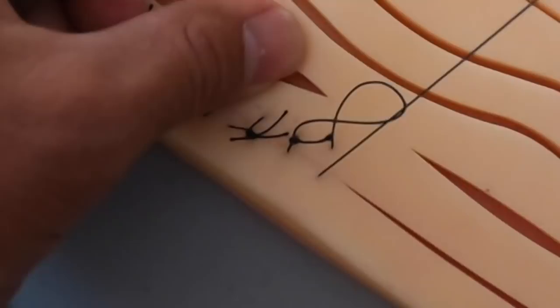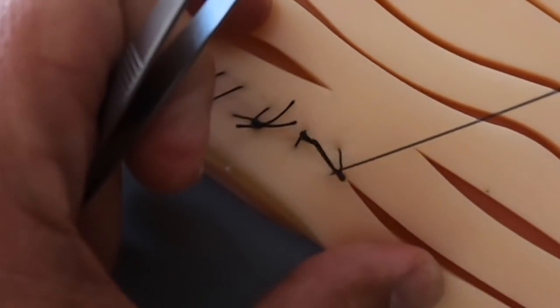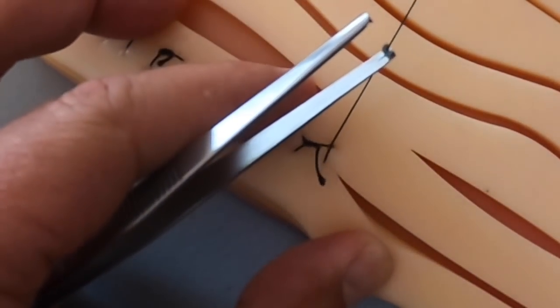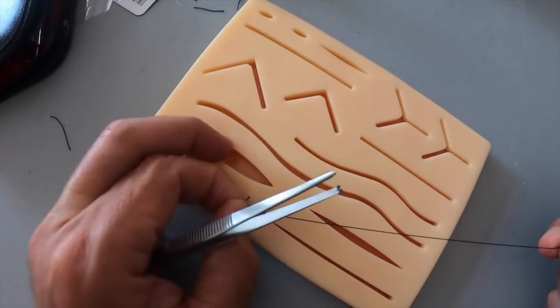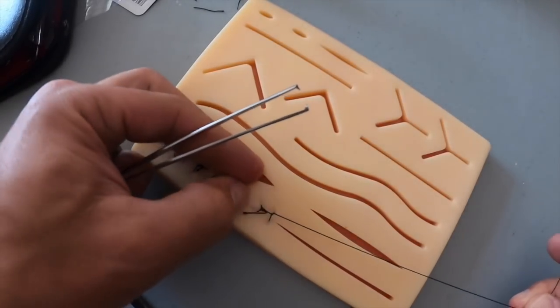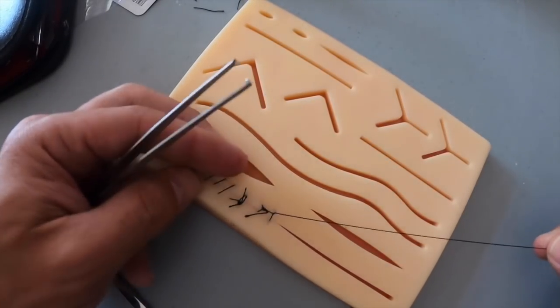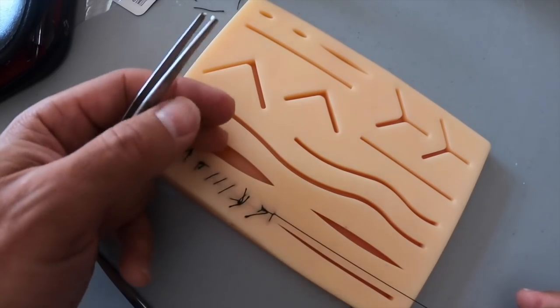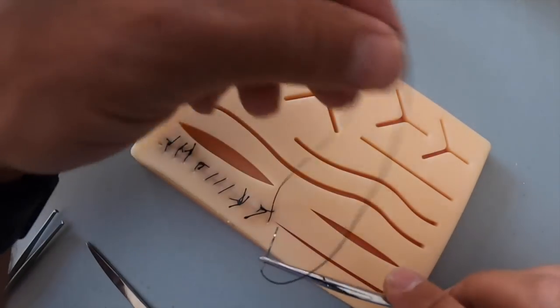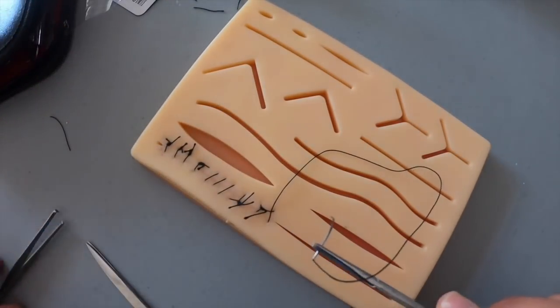And grab your needle again and then you're going to pull. And see what it does here, it's going to pull on that stitch this way, and as I continue to do this alongside the wound it's going to have what some people call the baseball stitch.